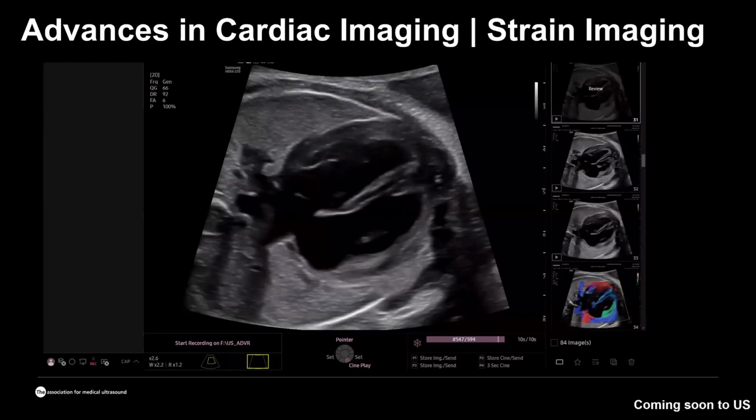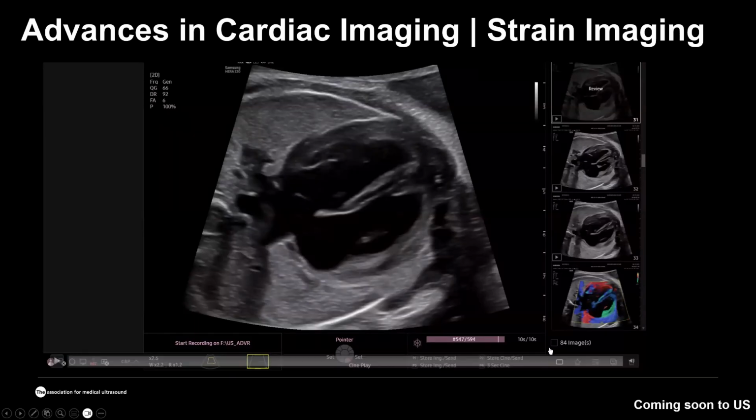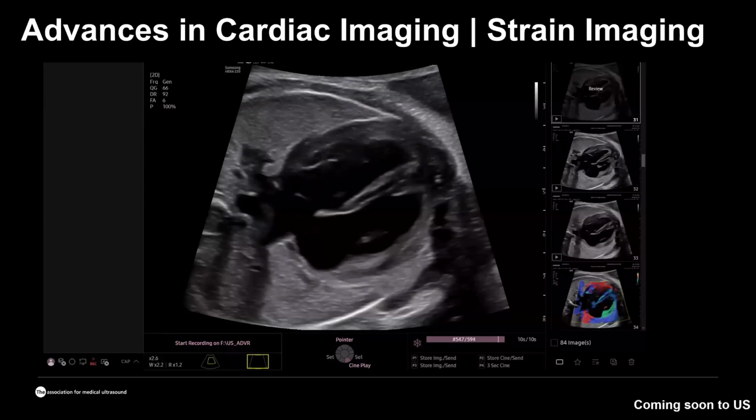If we are expanding on the imaging of the cardiac function, I also want to show you how the latest technologies, which are coming soon to the United States, can be simplified with the use of automation and artificial intelligence. Strain imaging is a very advanced technique, and it is in our guidelines. It's not required, it's optional and reserved for certain clinical situations. Here I would like to show you how you can simplify that.